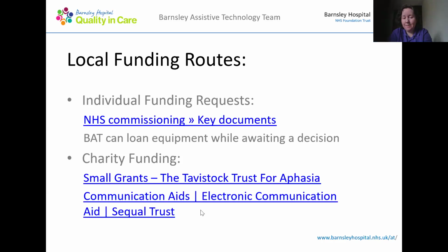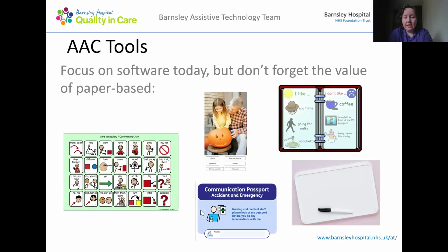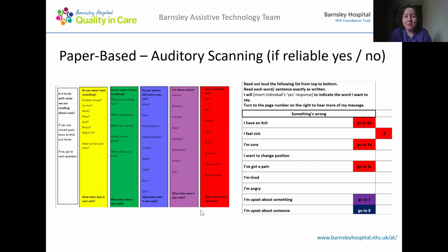So I'm just going to go through some of the AAC tools for the next bit. I'll go over this very quickly because I'm sure you're all familiar, but paper-based is really valuable, and we have some great resources on our website. The ACE Centre too have some great resources, lots of different types of communication charts and books.